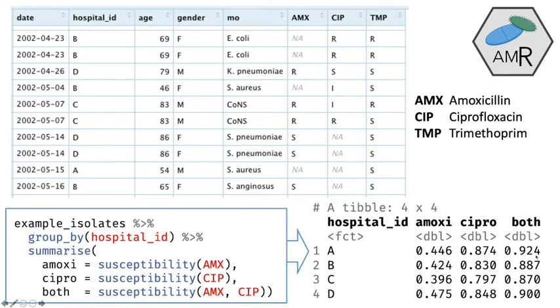But if you combine the both, you would get a success rate, empirically, of 92.4%. So that's a big difference. So using this package, you can also evaluate treatment and give advice on which drugs would work best in what way, or for which hospital, for which ward. You can group on anything, right? On hematological patients, or patients with respiratory diseases.